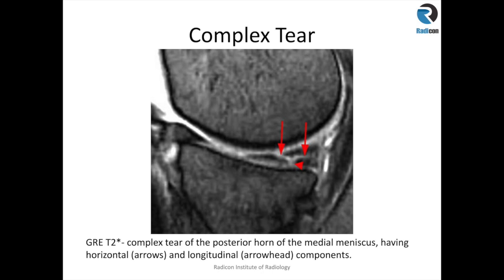Here is an example of a complex tear. There are two components to the tear: one is a horizontal component highlighted by the red arrows, and the arrowhead points towards a longitudinal tear which reaches the undersurface. This is a combination of horizontal and longitudinal tear, therefore it is described as a complex tear.